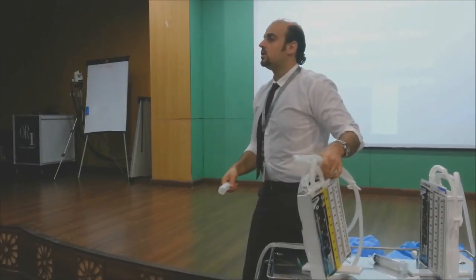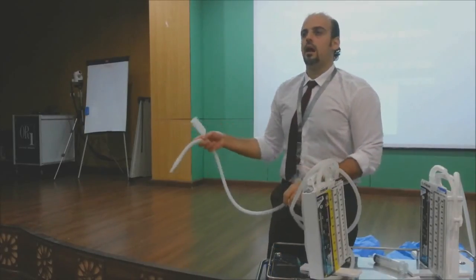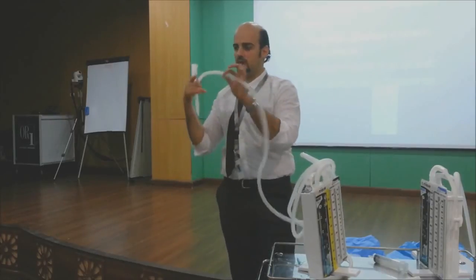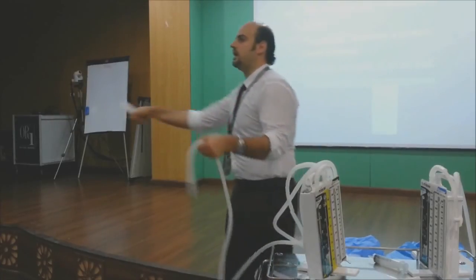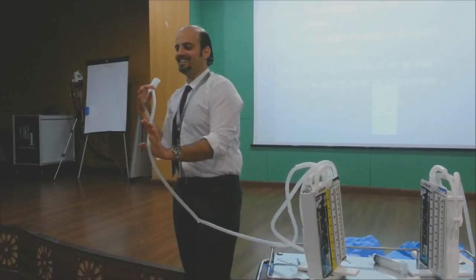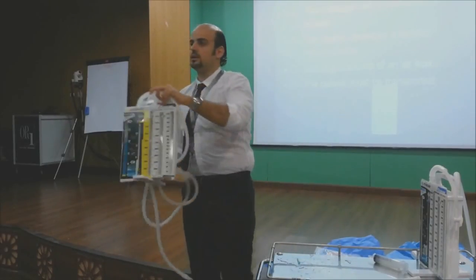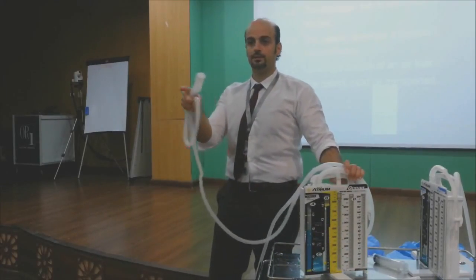One, if it's full, you change it. Two, you are not allowed to put the line below the pillow. I know you put pillows below the arms of the patient. It's always above, just to see it. Maybe you are very tired from checking the patient and wearing this yellow bloody stuff, and just leave it in front of your eye. You are not allowed to pass above the patient. You are not allowed to spill.